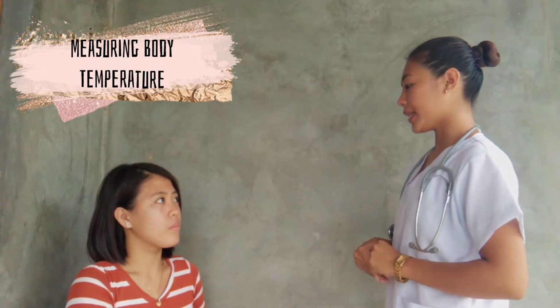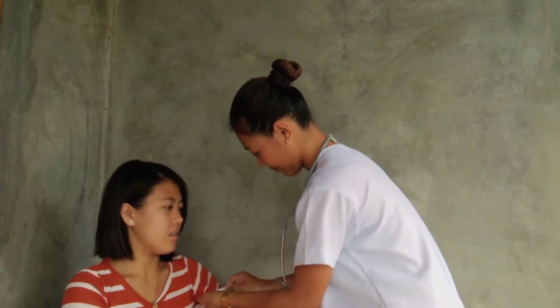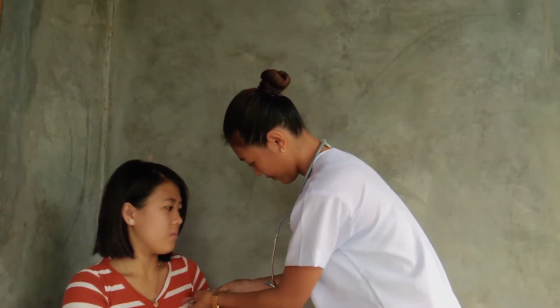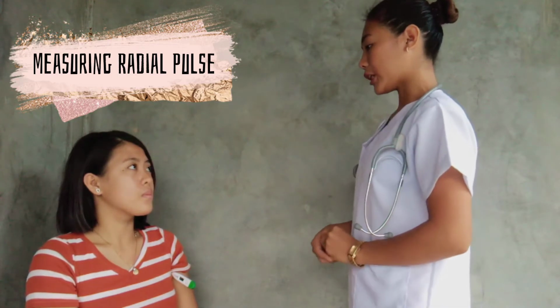Next, I will be taking your temperature. Is it okay with you? Yes, it's alright. We will be using your axilla for the reading. While waiting for your temperature, ma'am, I will get your pulse rate. Is it okay with you to touch your hands?